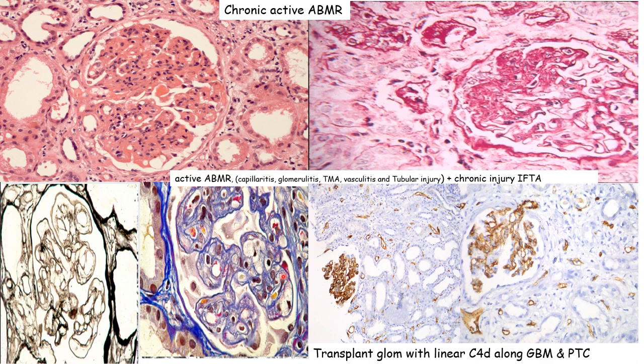Along with this, where you may have an MPGN pattern, in some scenarios, the patient may have an FSGS lesion. Both can be associated with chronic humoral rejection. However, to be 100% certain that it is due to chronic humoral rejection, a C4d staining of the glomerular capillary loops is essential, which confirms the primary chronic humoral rejection phenomenon, because transplant glomerulopathy can also be seen in patients having chronic T-cell mediated rejection.